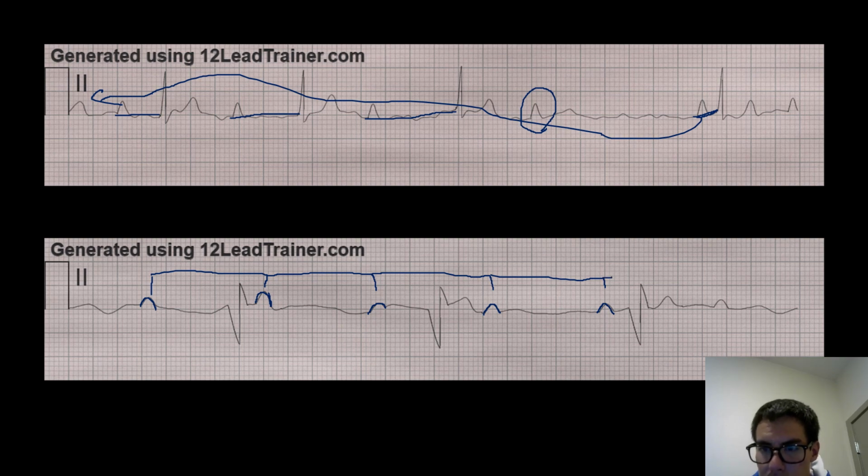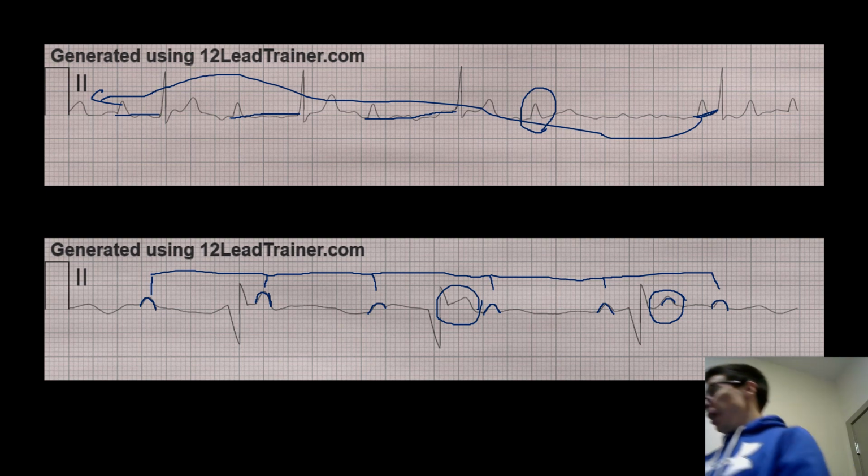and so one right there. The weird thing about this is this one right here actually kind of looks like a P wave stuck in the T wave, but the other thing is this QRS right here does not look like that one. And this does, oh, you know what? I just realized what I think the problem is or what that is. So that probably is actually a P wave.